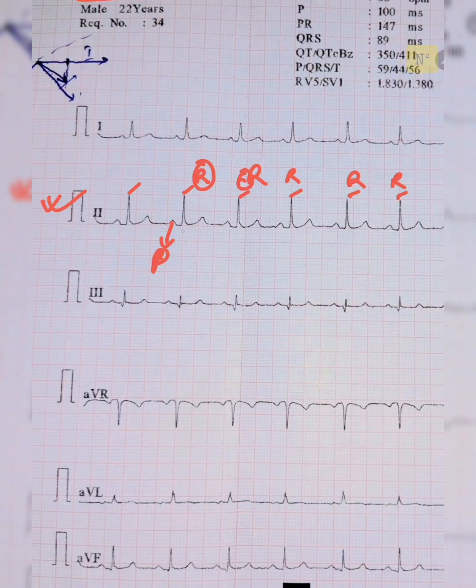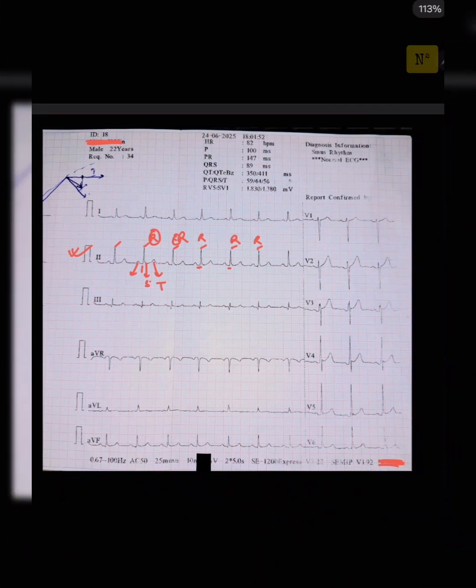There is a very slight curve, but it's a negative Q wave, which in certain curves is not visible, but here again it is visible, so it varies. You have to analyze along with the other curves also. So this is a P wave, then a negative Q wave, then a positive R wave, and here there is no S wave. There should be an S wave in other curves also. And last is the T wave. Now these are the curves. Let's learn about the individual curves first of all.